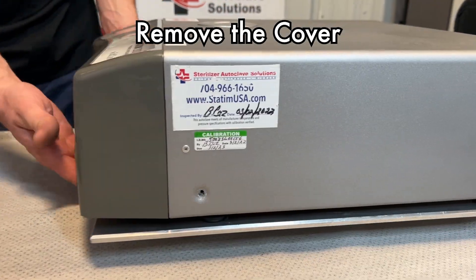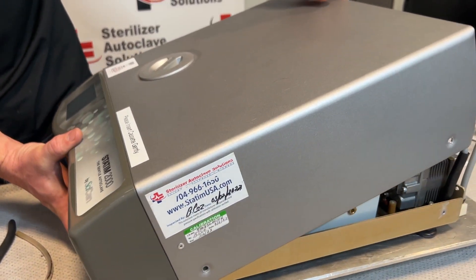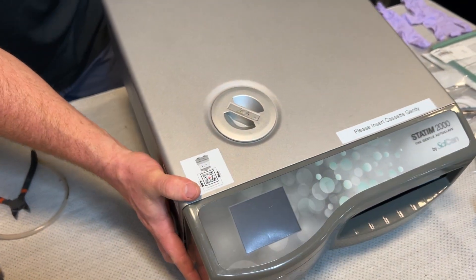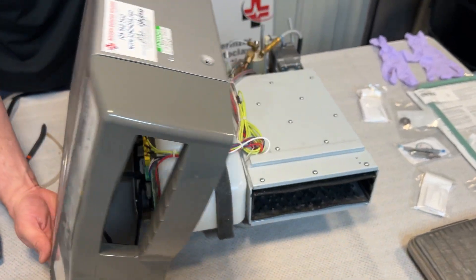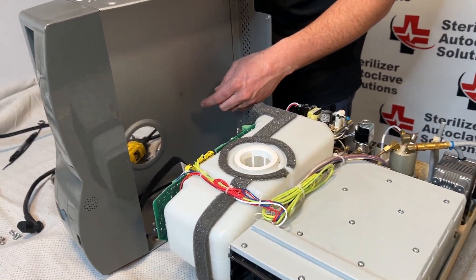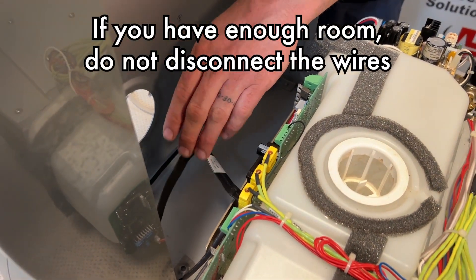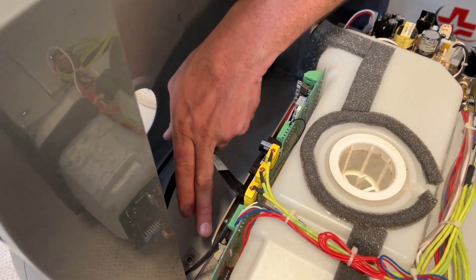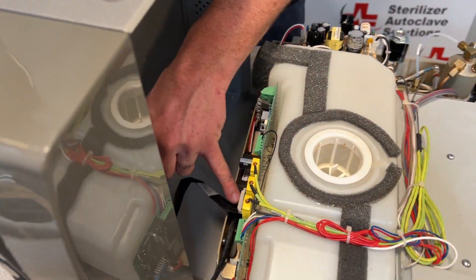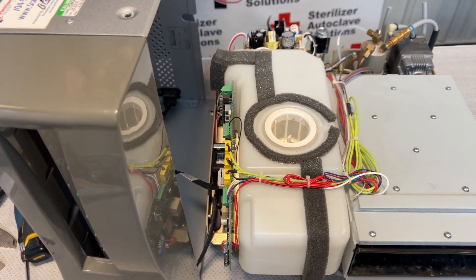The easiest way to remove this cover is to bring the feet to the edge of the table, lift up on the back of the unit, make sure you have room on the side, then slide the cover so it sits on its side. This cover is connected by two wires. If you have room, you do not need to remove it completely. There is a power supply board that plugs in as well as a different cable — if you have issues with that, please give us a call. I am not going to be removing this one completely.